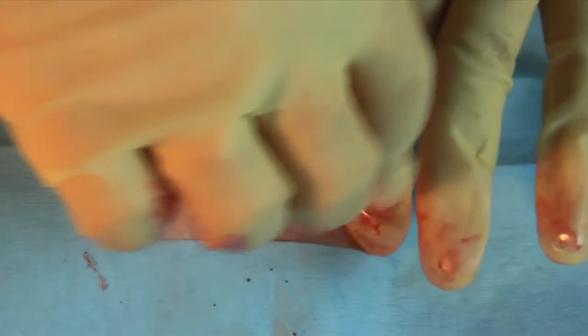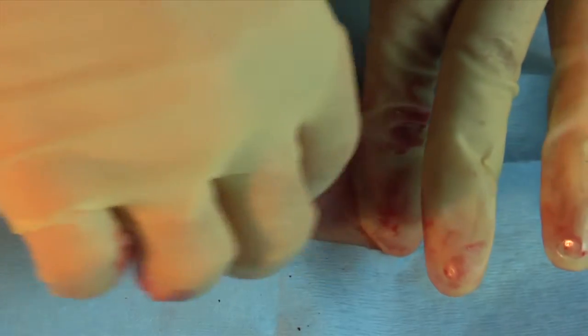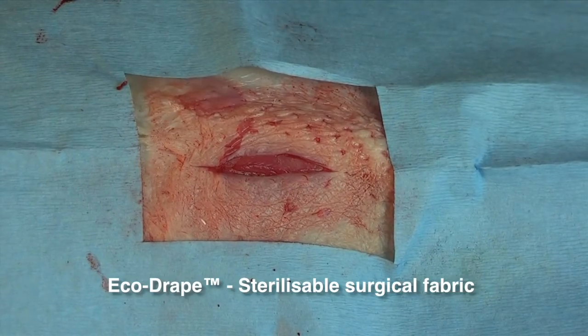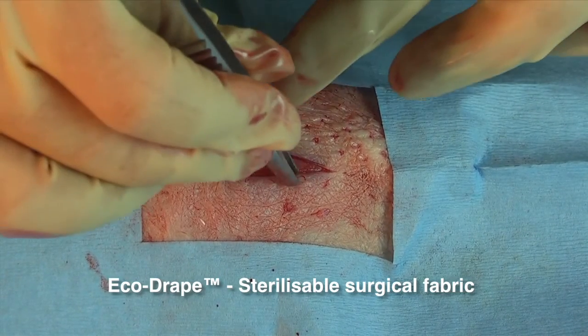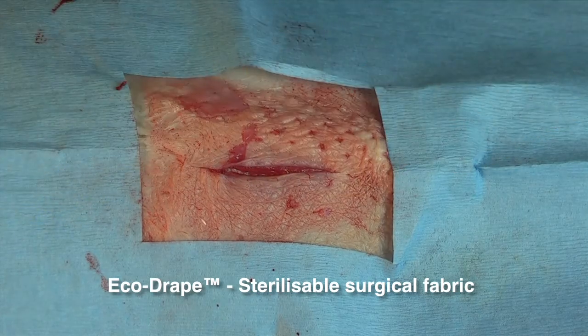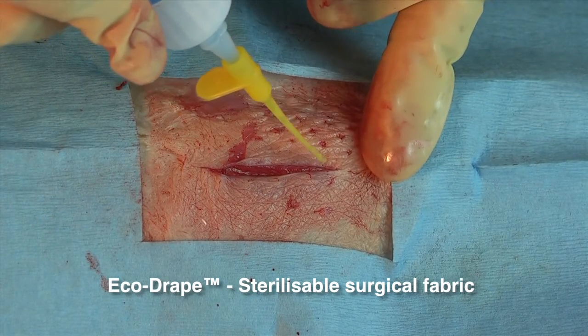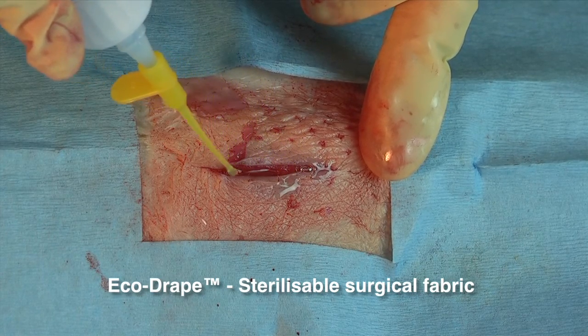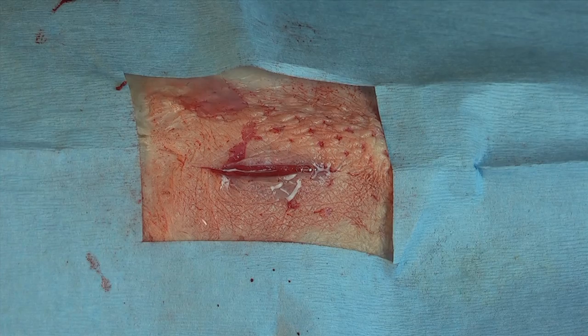After the surgical procedure is complete, to ensure the best adhesion of Dermafuse and to avoid any excessive exothermic reaction, ensure your application site is free from excessive fluids. Now you can approximate the edges of your wound or surgical incision. You will apply your Dermafuse sparingly to the surface of the site to form a thin layer. Thick applications will crack and lift prematurely.